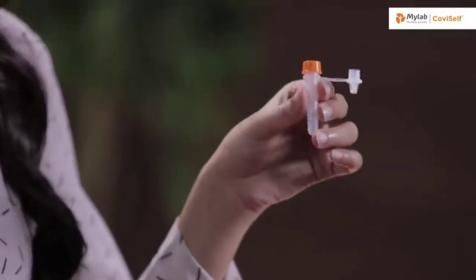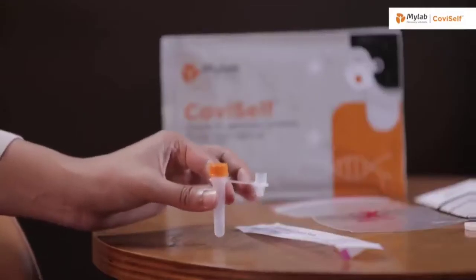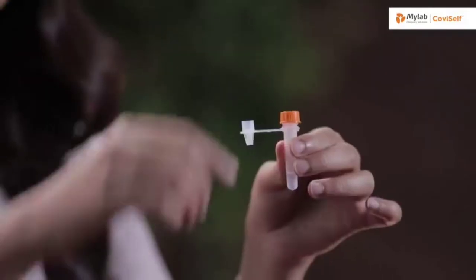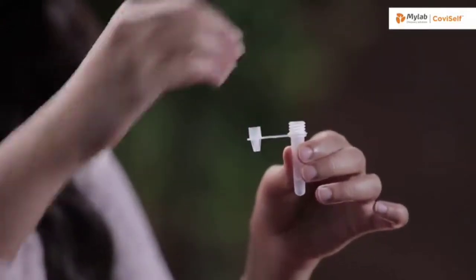Take the pre-filled extraction tube and tap it gently three or four times to ensure that the liquid settles at the bottom. Unscrew the cap and hold the tube in your hand.